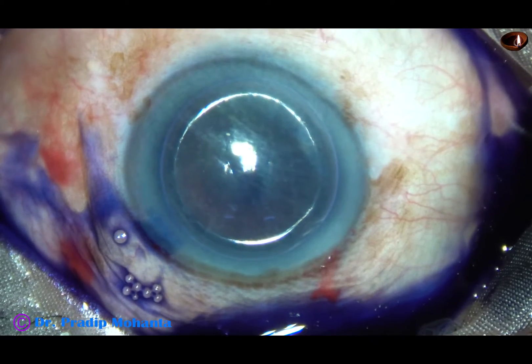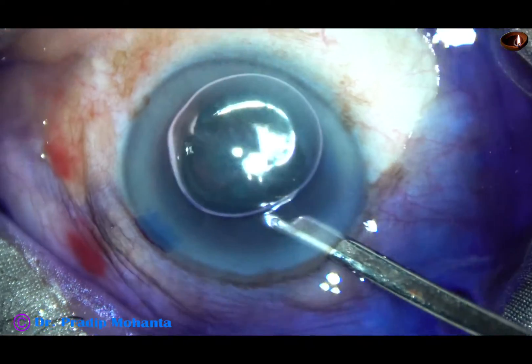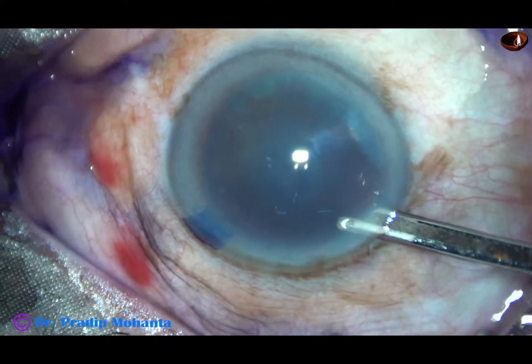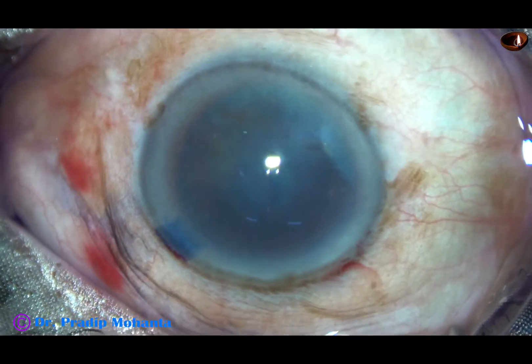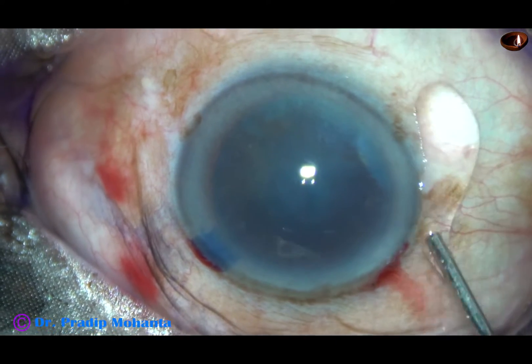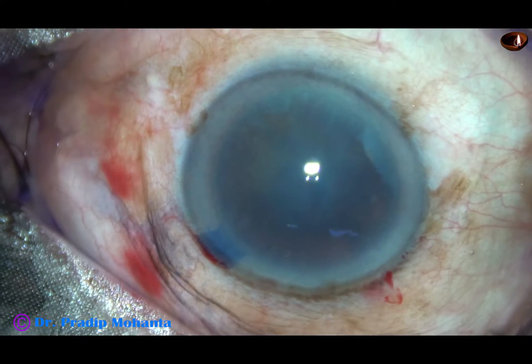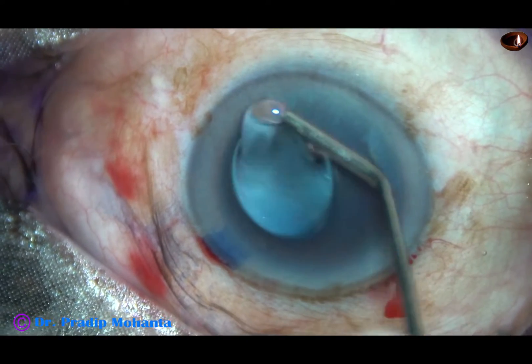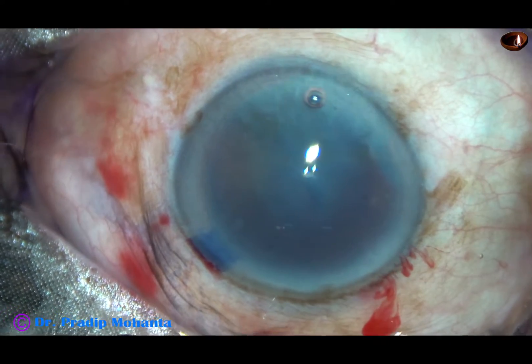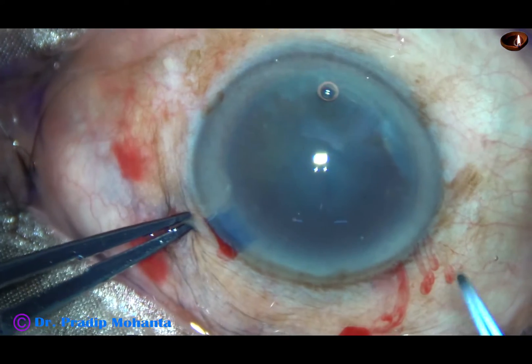By this time, the main incision and a side port on the left side of the main incision has been made. The trypan blue dye is applied underneath an air bubble to stain the anterior capsule. The dye is being washed out at this moment. Now 2% HPMC is injected into the anterior chamber and applied over the cornea for better visibility. It improves the visibility a lot and does a little bit more magnification.